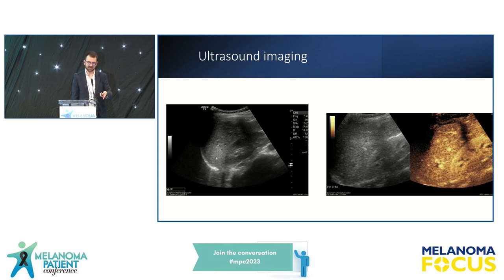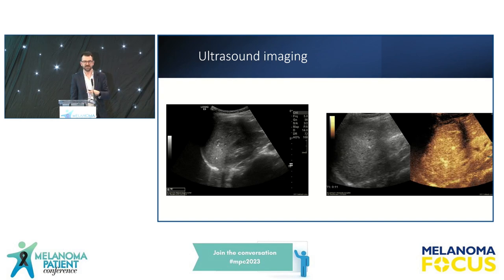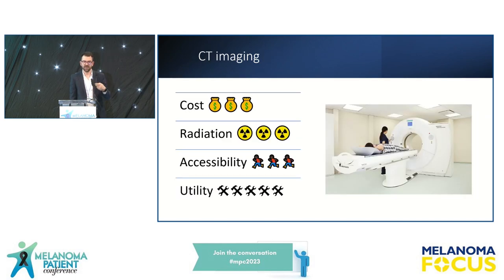And if this turned out to be something that we were worried about on the contrast ultrasound as well, we could then perform a biopsy at the same time. It's kind of like a one-stop shop, really. And again, for patients in Leeds, Howard and the team take referrals from as far east as Scarborough and up to Newcastle and down to Nottingham. So patients often travel a large distance for their clinic appointments, radiology investigations, etc. If we can offer kind of a one-stop shop service for imaging and biopsy, then it's obviously better for them.